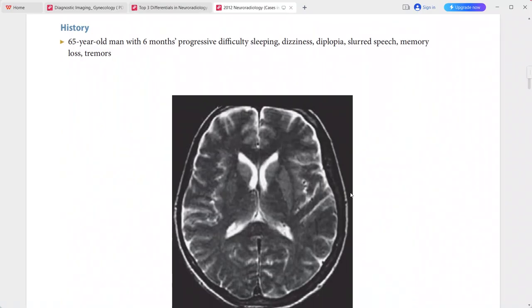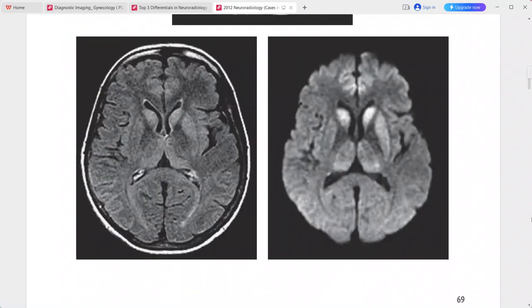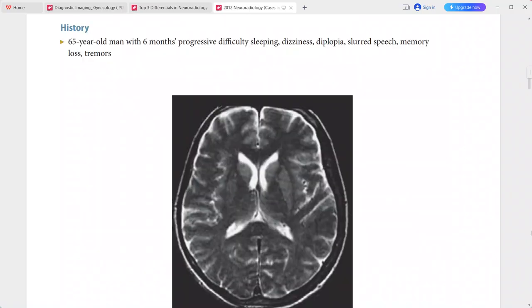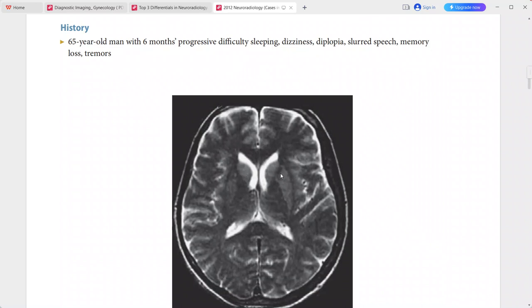Next: a 65-year-old man with six months of progressive difficulty sleeping, dizziness, diplopia, slurred speech, memory loss, and tremors. T2-weighted MRI shows subtle hyperintense signal within the caudate head and putamen bilaterally.